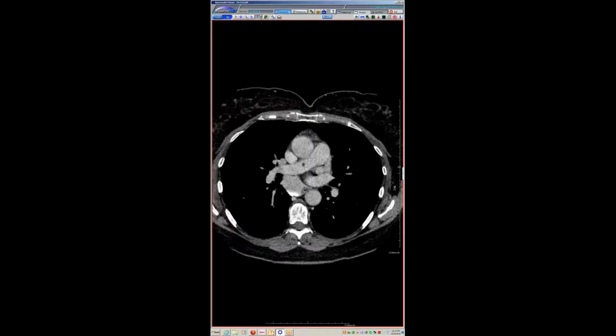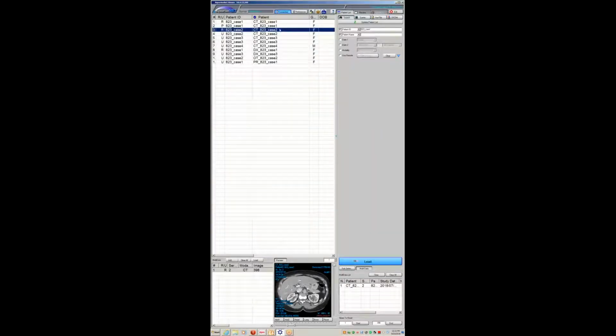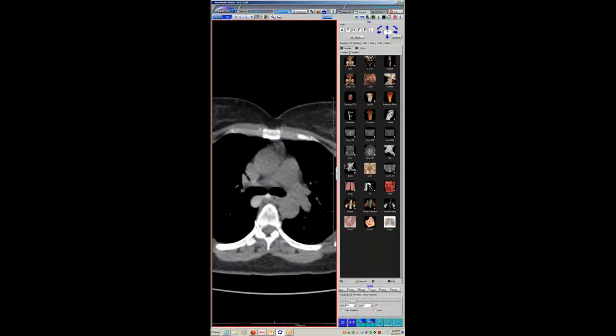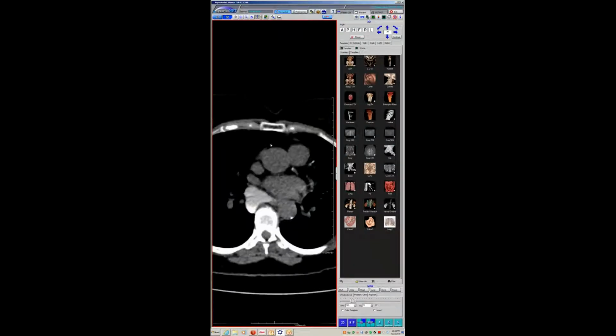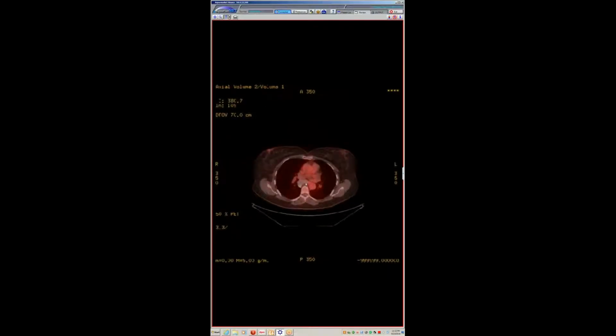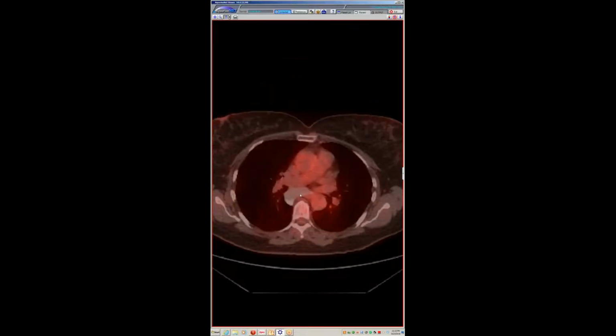I still think it's a pretty classic diagnosis, even though it's high density, but this was called something potentially worrisome, and the patient underwent a PET. You can see here on the non-contrast scan that this is extremely high density, and that there's a layering milk of calcium level in it. Where are the PET images? I'll have to include the PET images. Oh, here they are. As you can imagine, on the PET it's just an area of no uptake. This is just an extremely high density bronchogenic cyst. I don't think I've seen one this high density with a layering milk of calcium level.